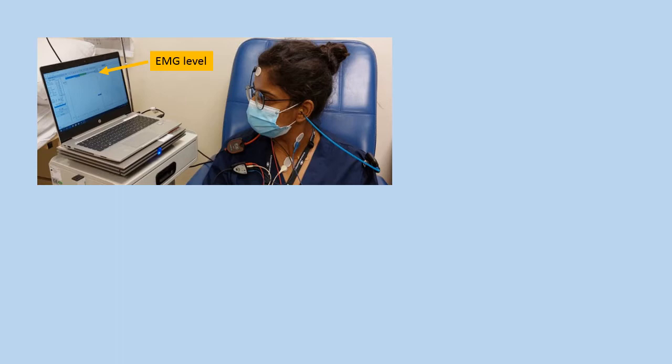So we may help the subject correct the muscle tension by asking them to refer to the visual feedback given through the EMG level meter displayed on the computer screen. The computer screen is advisable to be placed at the side of the subject's headrest. As you can see from this photo, Dr. Nisha is controlling her neck muscle tension by looking at the EMG level.